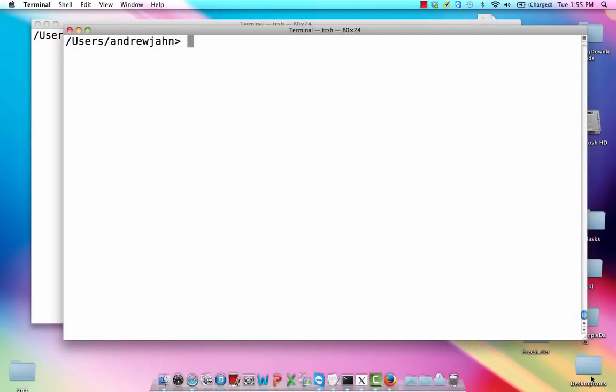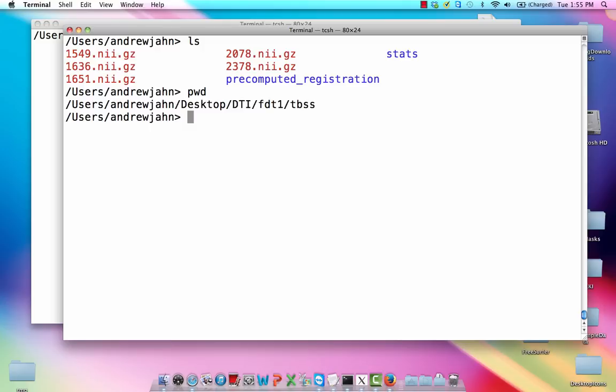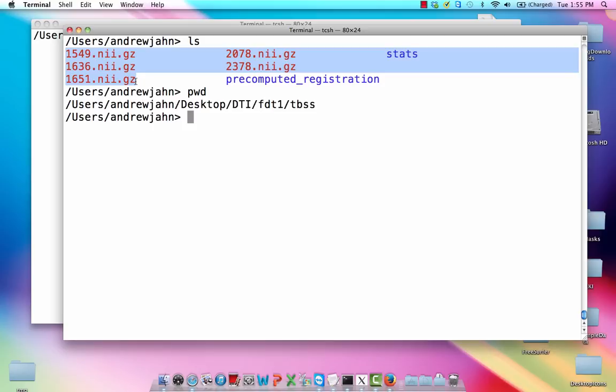First of all, just to give you an overview, after we have all of our fractional anisotropy maps, we put them all in a single directory. And just for the record, I'm using the pre-cooked data, all the stuff online on the FSL website, and I'm in FDT1/TBSS. So these five, there used to be six.